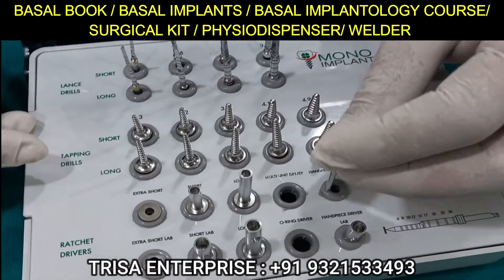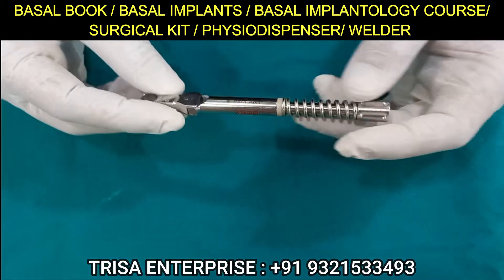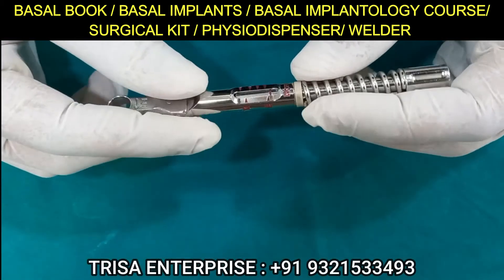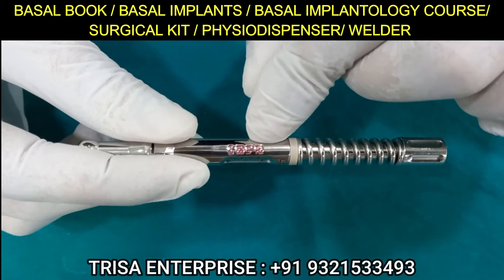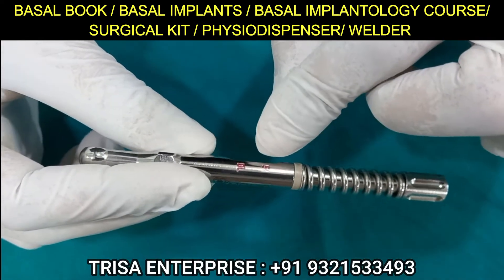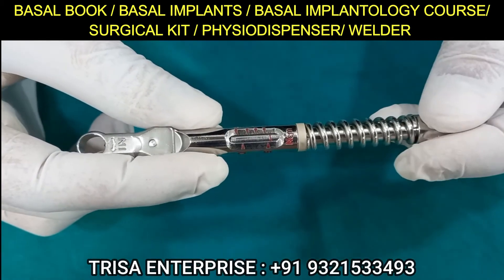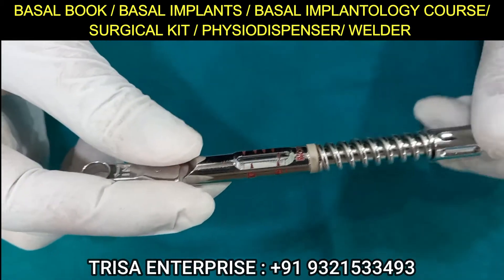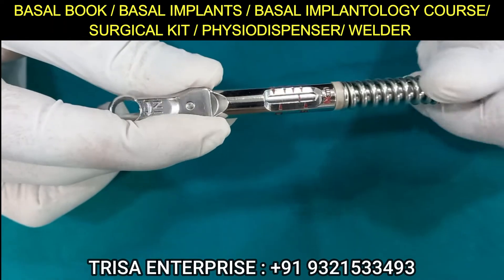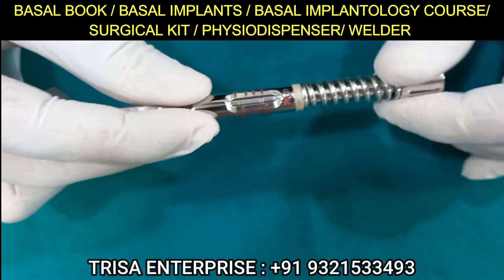The most important thing to understand, especially for beginners, is the ratchet. This is the advanced stock ratchet. The markings on one side read 20, 40, 60, and infinity; on the other side the markings are 15 and 70. There is a line in the center — if you want to set the ratchet at 40 NCm, turn it until the line reaches 40 NCm. If you want 20 NCm, keep the line at 20 NCm, and so on.